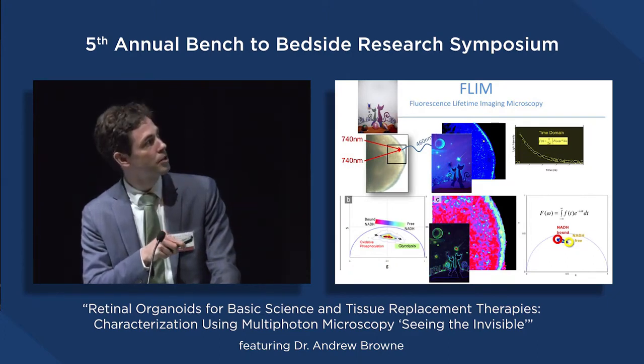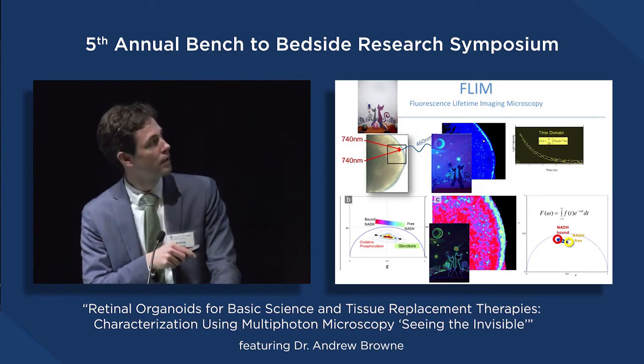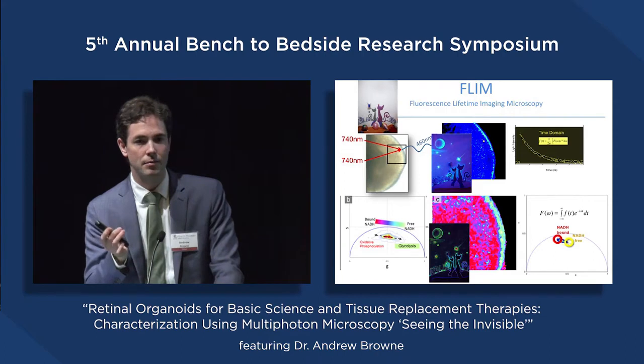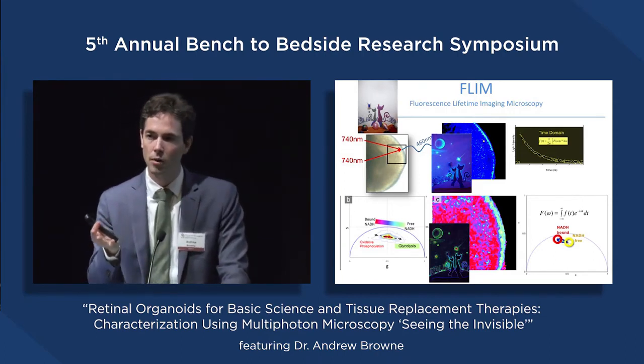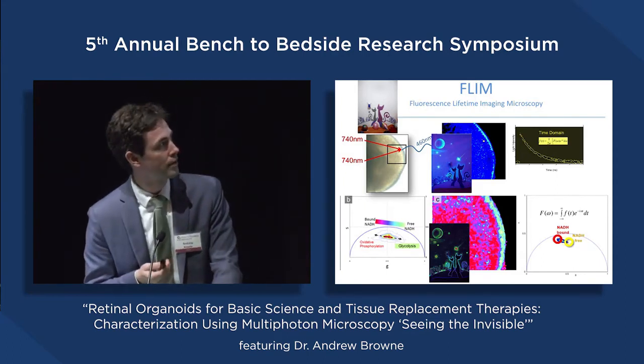And it's hard to appreciate, you'll see better in some later slides, that there is a dark band of autofluorescence, and that corresponds to where the nuclei are. So this is the glow in the dark. This is the galaxy in the sky, but really looking at what information is encoded in that glowing light is where the elegance of this technique arises.